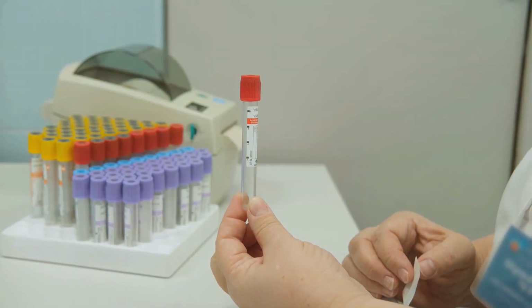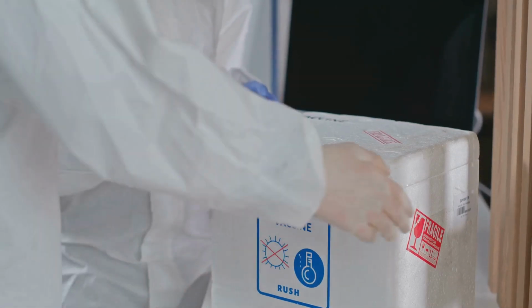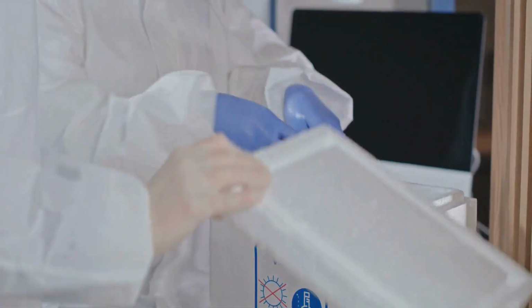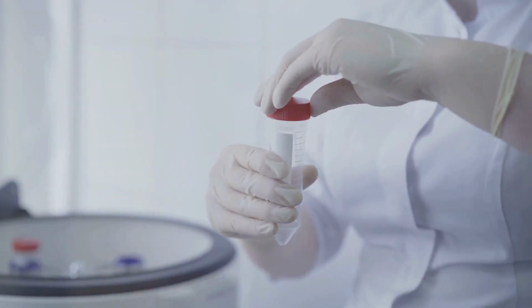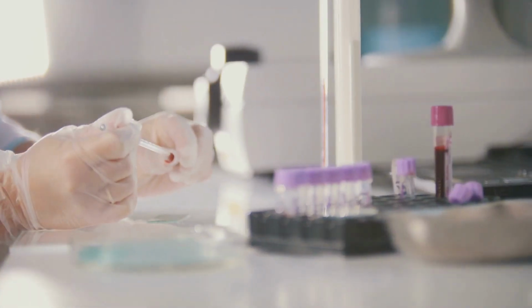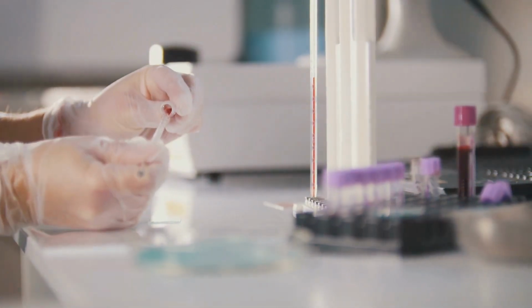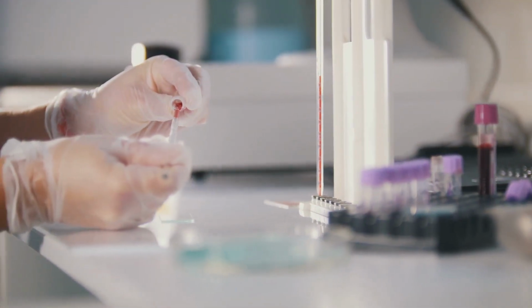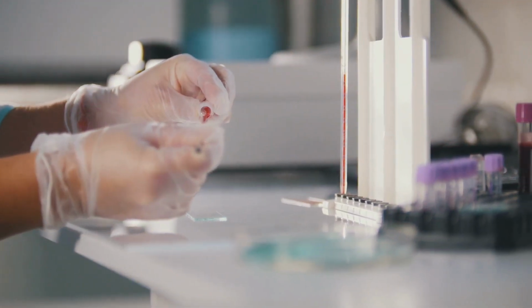Section 5, Clause 4, Sample Collection, the first link in the chain of custody. The journey of a medical laboratory sample begins with its collection, marking the first and crucial step in the chain of custody. This initial step is critical, as any errors or deviations during collection can have a ripple effect, impacting the accuracy and reliability of the entire testing process, potentially leading to misdiagnosis or incorrect treatment.